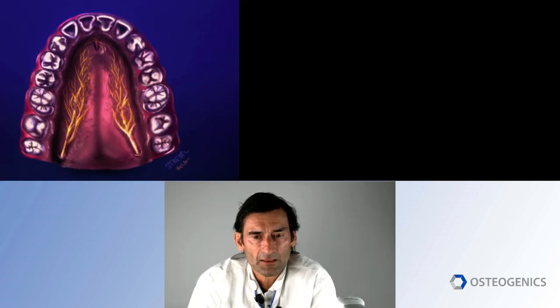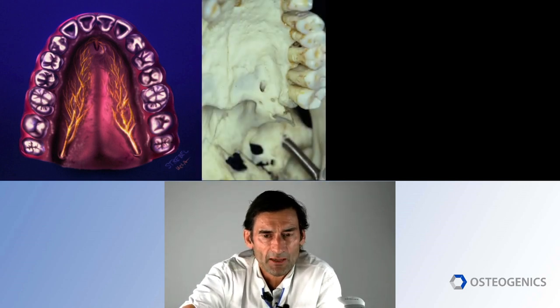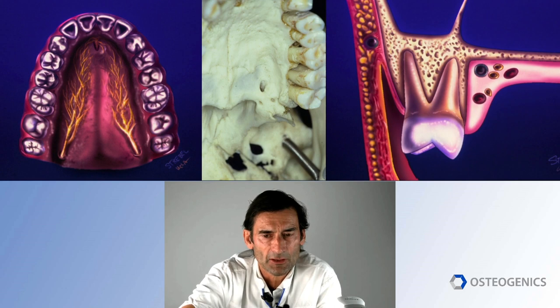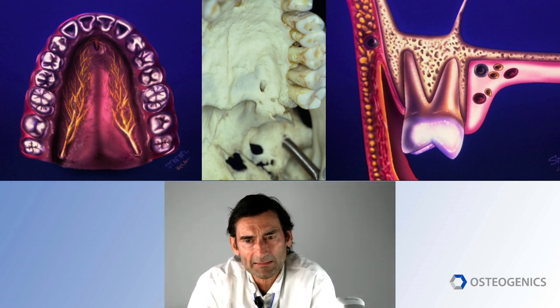Then I'm going now to a special suturing technique for the connective tissue graft. This is one which, if I have time, I'll show you. When I go to the palate to harvest some tissue and take a connective tissue graft from the palate, again, I like to use PTFE cytoplast.